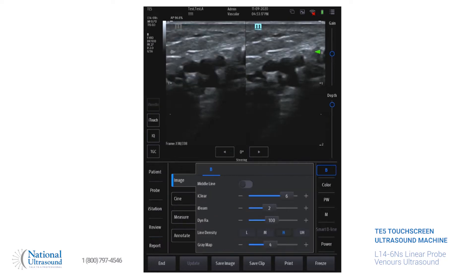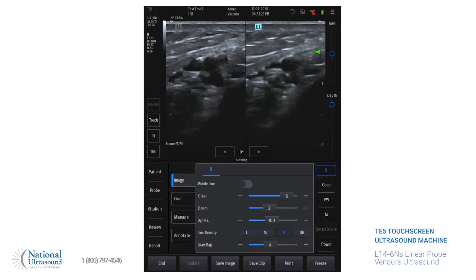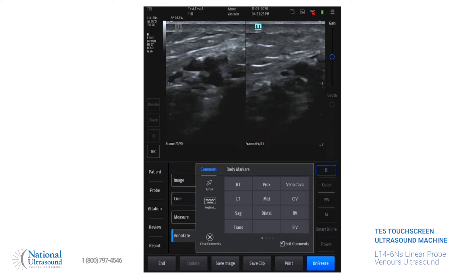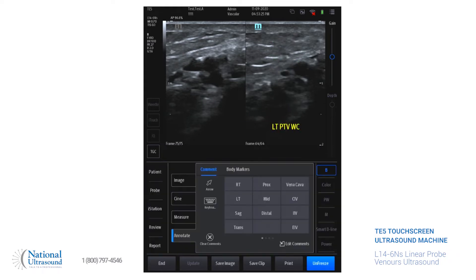For the dual screen, you just hit dual, and since this machine has a touch screen, you just click right or left. We have that, and then we'll compress. Hit freeze. For annotation, you can type it out on the keyboard or you can use the abbreviations. I personally just like typing it out. Left posterior tibial vein with compression — and you can move this wherever you want to, right or left, up or down. Then we'll hit save image.